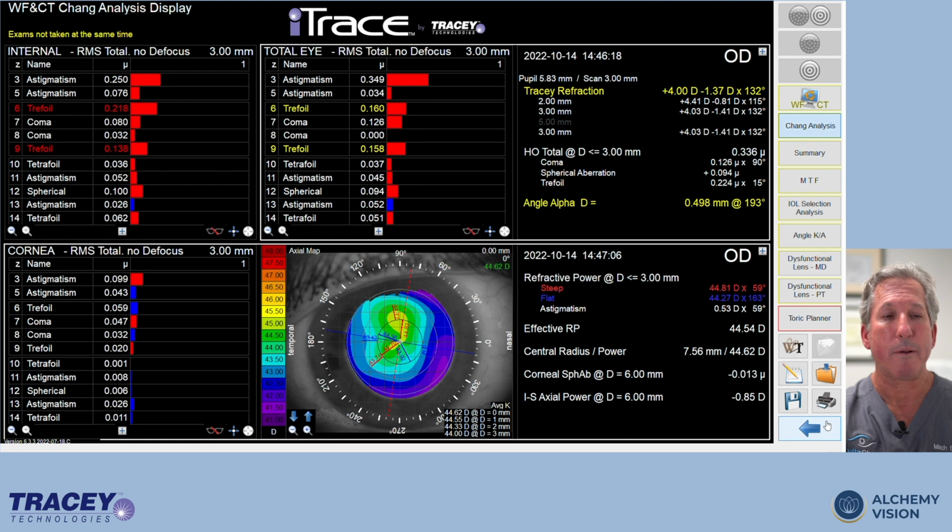So post-operatively, we actually purposely made her a little bit more nearsighted and then came back the other direction to enhance her vision exactly to where she wanted and give her that high quality of vision by neutralizing the spherical aberration.